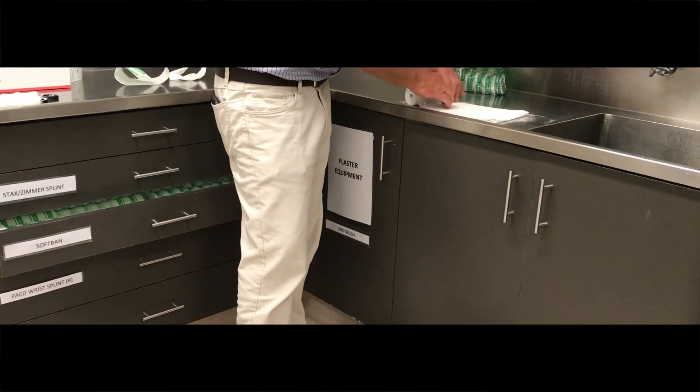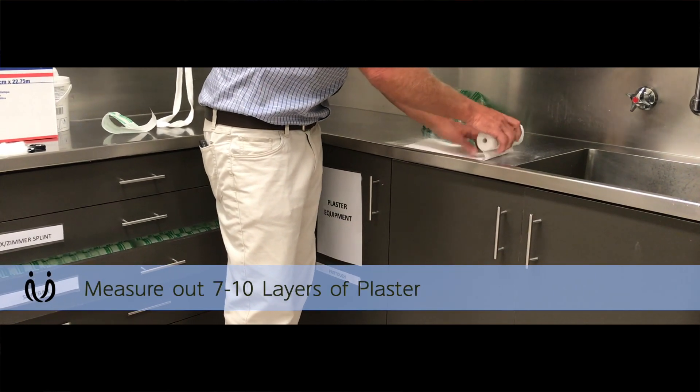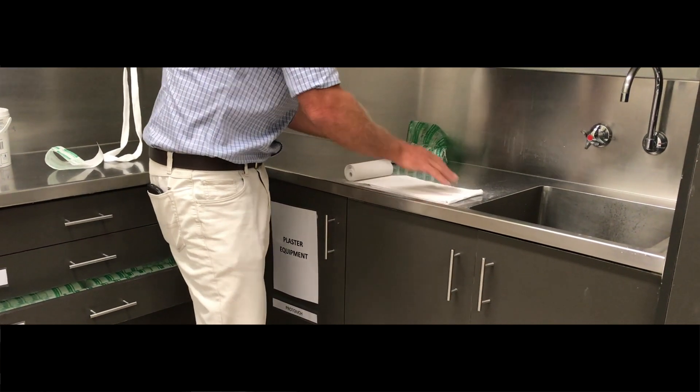And then how many layers of plaster do you reckon? I use about seven or eight. If you don't put enough on, it just won't be hard enough and they'll move and all the plaster will crumble. And there's your seven layers.